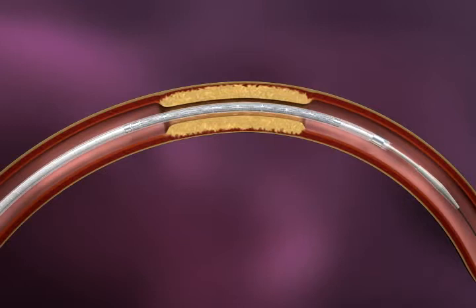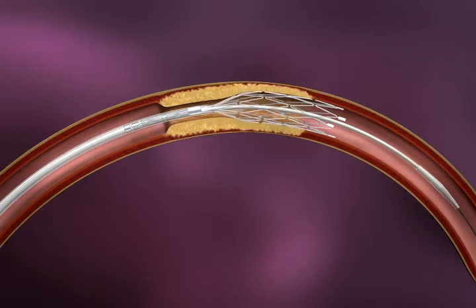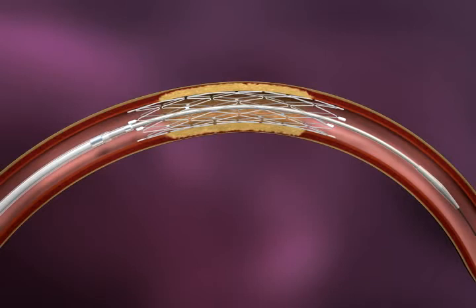To deploy the stent, the inner body should be held stationary with one hand while the other hand withdraws the outer body. This results in an unsheathing of the stent.